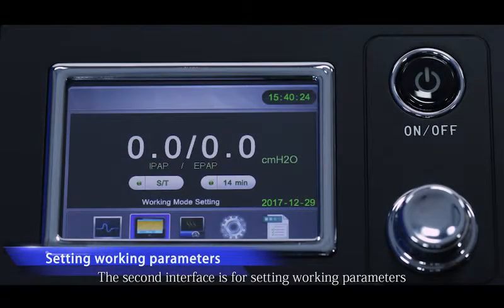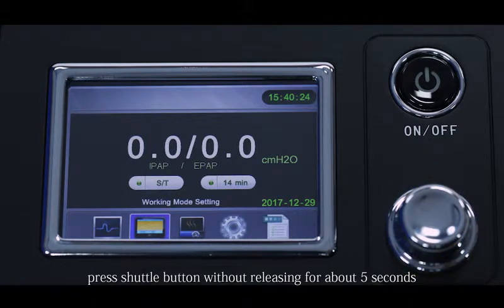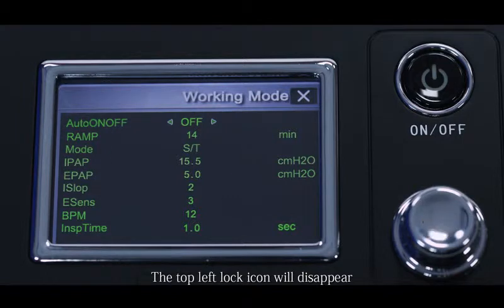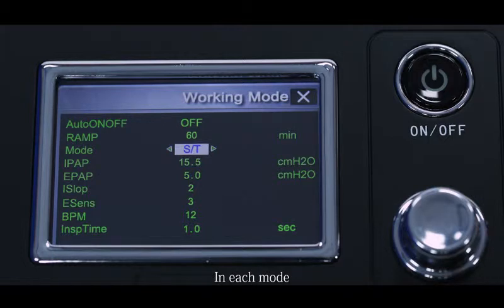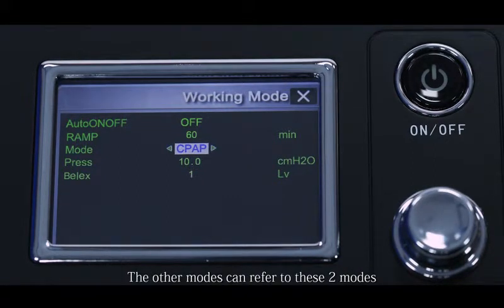The second interface is for setting working parameters. Move the cursor to the working mode icon and press the shuttle button without releasing for about 5 seconds until you hear a beep — the lock icon in the top left will disappear and the system enters the parameter setting interface. To ensure user safety, you must unlock the device before setting important parameters. There are four work modes for the B19: CPAP, S, ST, and T. In each mode, the adjustable parameters are different. The user can select the working mode as required and adjust the corresponding parameters. I will now introduce ST mode and CPAP mode; the other modes can refer to these two.